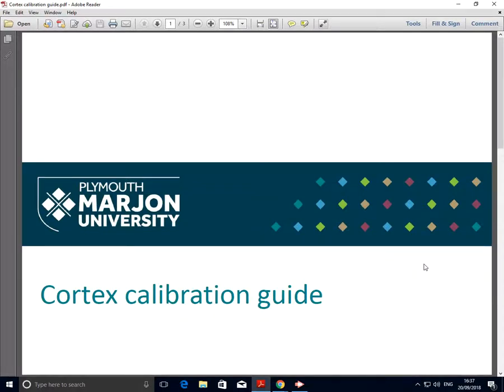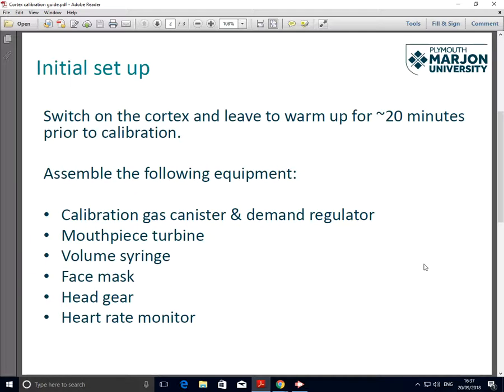The purpose of this video is to provide a quick demonstration on how we calibrate the Cortex system. Prior to calibration, it's advised that we switch the Cortex on for around 20 minutes to allow it to sufficiently warm up.